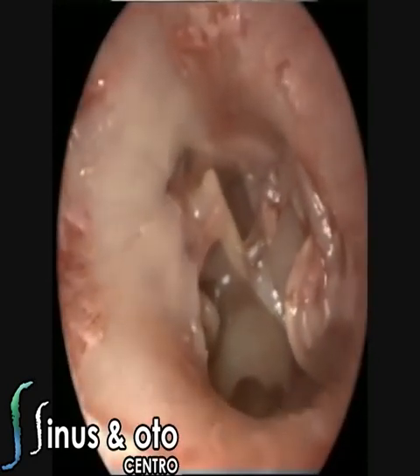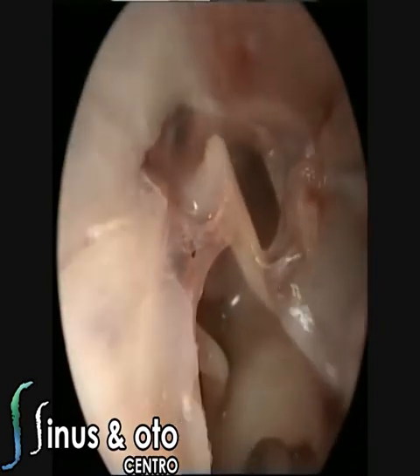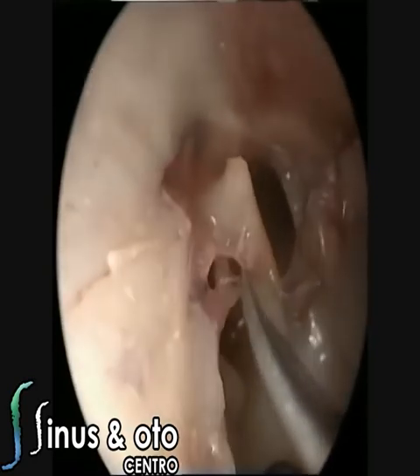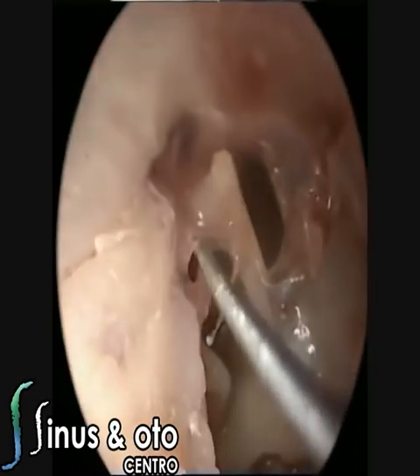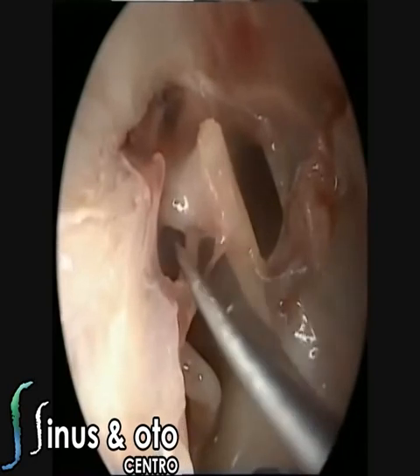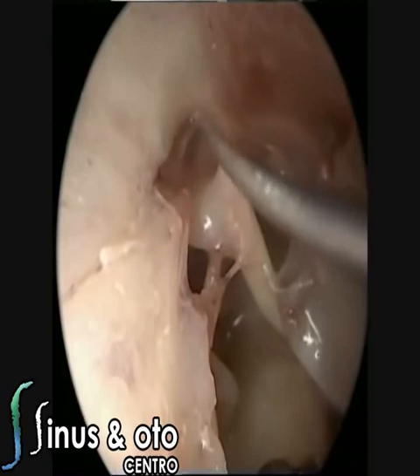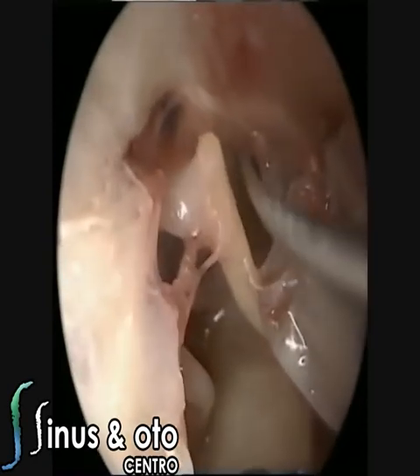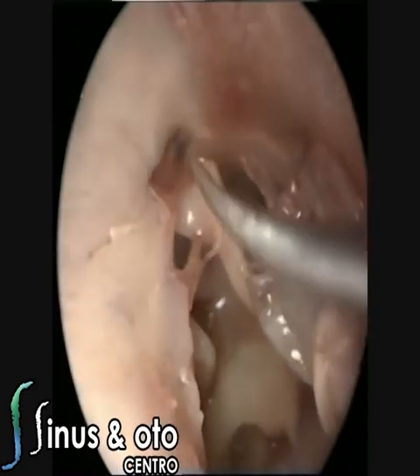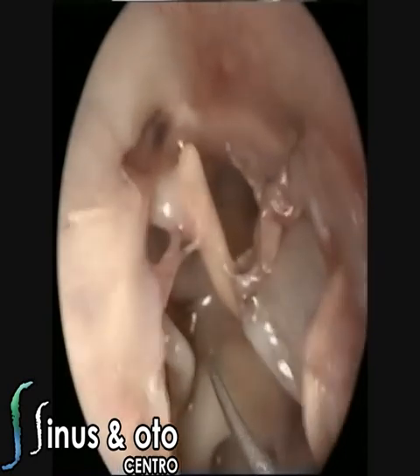The air comes from the eustachian tube and goes all the way to the mastoid. In order to make this way, the air has to pass through small zones that we call isthmus. So we have the tympanic isthmus, which is between the malleus, the cochleariform process, and the long process of the incus. We have the posterior isthmus, and we have the anterior spaces where we can find blockages. Sometimes we can have a blockage at the anterior space, and sometimes we can have inflammatory folds that close all these tympanic ventilation routes.